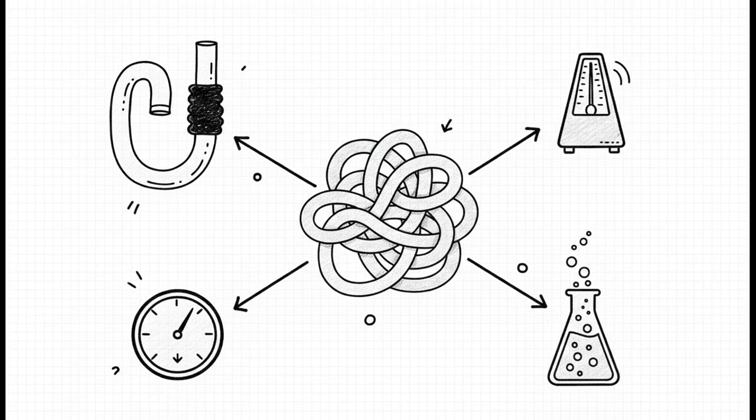First, check the tube. Is it blocked? Because if it is, the baby literally cannot breathe. Next, are your pressures high enough, or is your set rate too low for what their lungs are going through? Also, watch out for metabolic acidosis or shock causing them to hyperventilate to compensate. Or it could even be neurological, like encephalopathy causing erratic breathing. Bottom line, find the root cause and fix it.